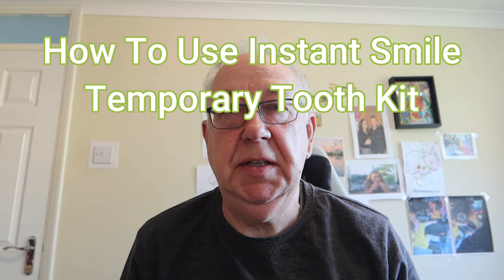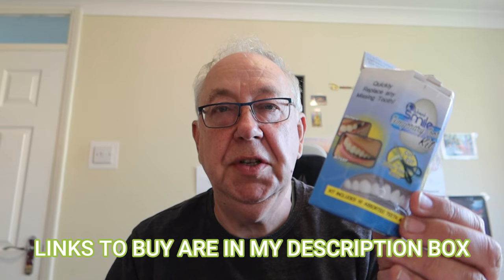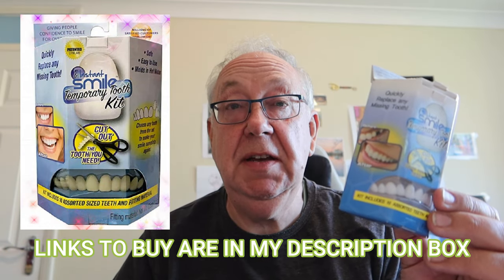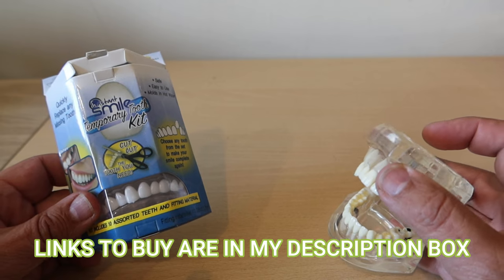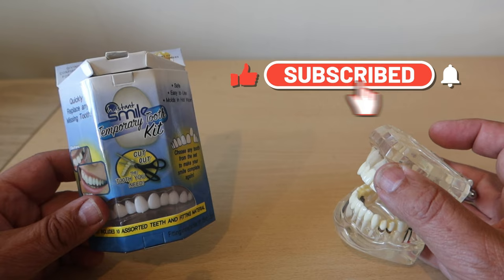Hello and welcome to MG Tracey. Today I'm going to be showing you how to use the Instant Smile temporary tooth kit. This may well get you out of a hole if you've lost one of your front teeth and you can't at the moment get to the dentist. I'd like to give you some tips and advice about this quirky but very useful product which might help you out of a tough spot.